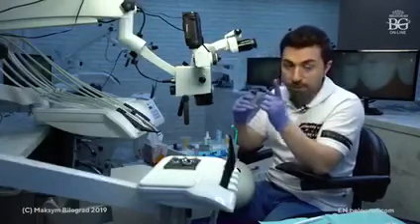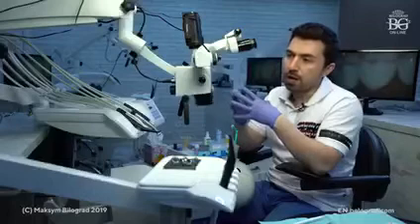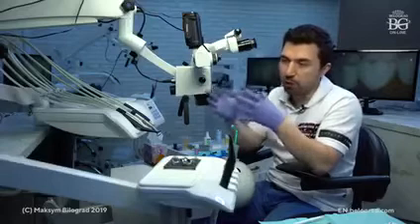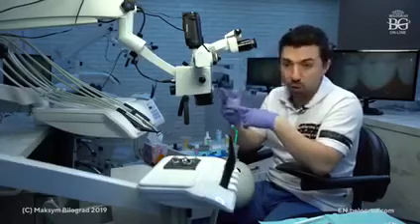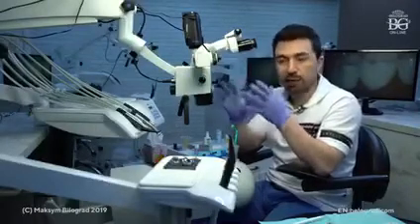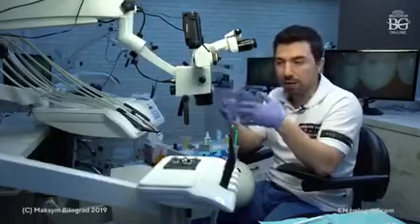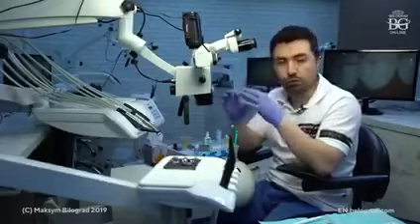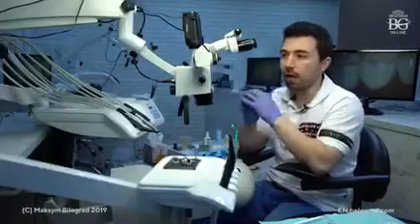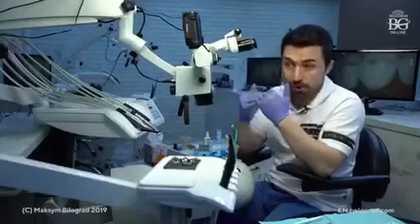We put in a retraction cord, okay? It depends on the biotype. But in almost all of my cases, in normal periodontium, I'm using the 000 or 00 retraction dry non-impregnated cord, just packing this cord really gently. Sometimes when my preps are really non-aggressive and preparation is done without anesthesia, you put the retraction cord also without anesthesia and the patient is okay with that. So you have to pack really gently, okay? And then you move your finish line to the same level as the retraction cord is, okay?